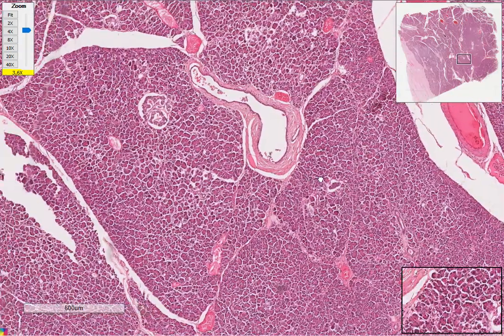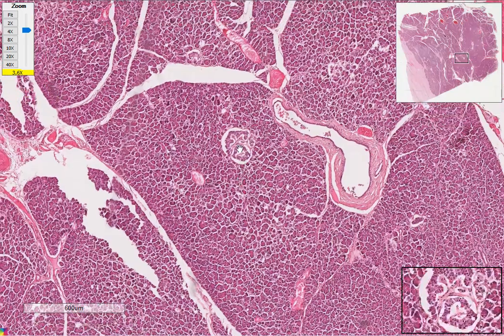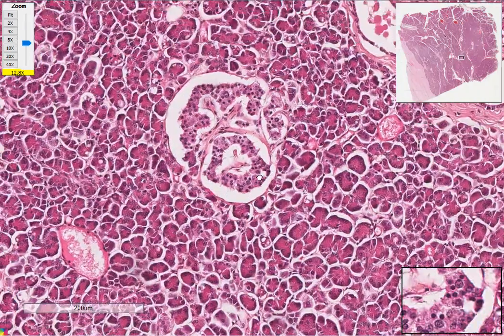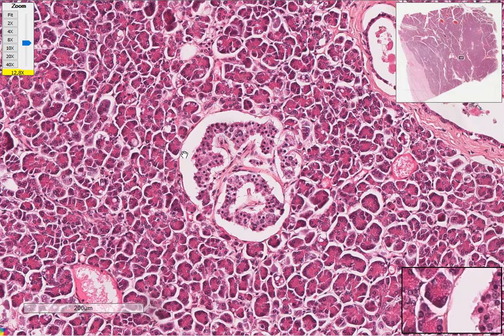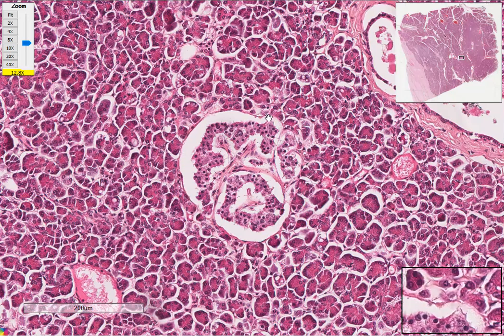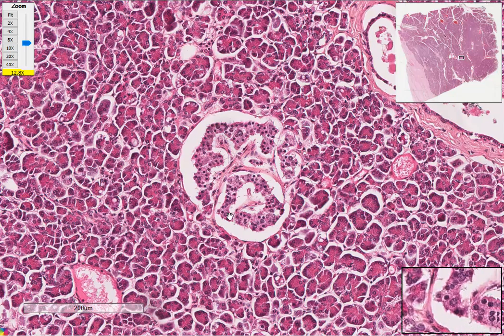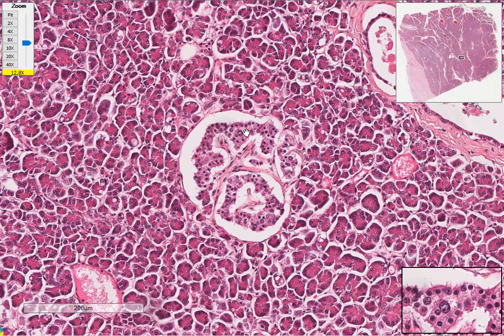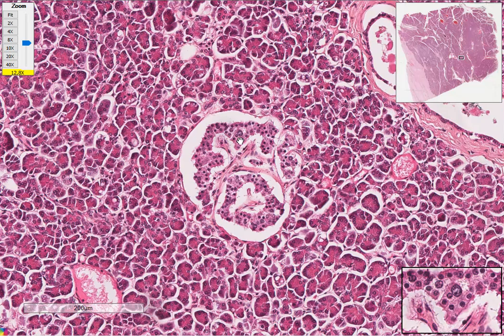Now we can move to the endocrine pancreas, which is this part here, which is separated by a thin membrane, a nice, classy membrane there. And then these are the islets. You can't really distinguish which cell secretes which, because if you remember, we have the alpha, beta, and delta cells of the islets of Langerhans.